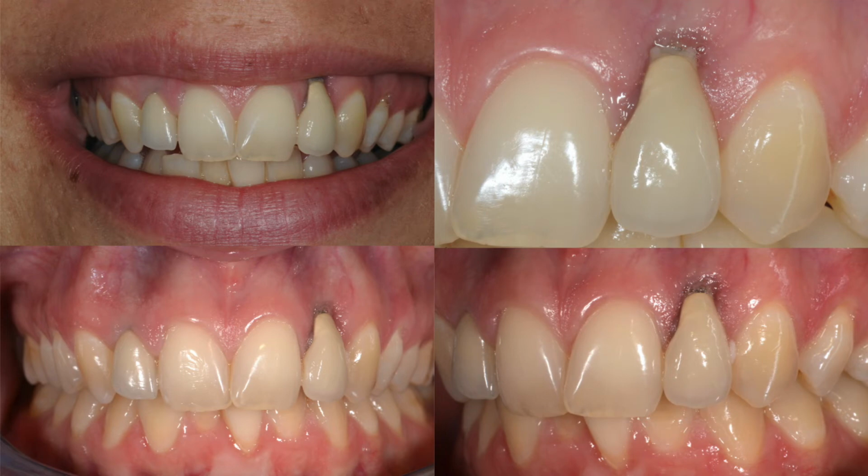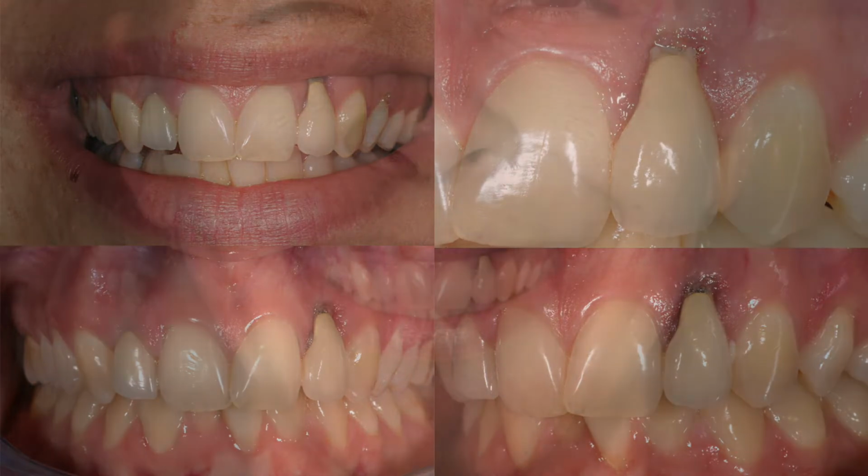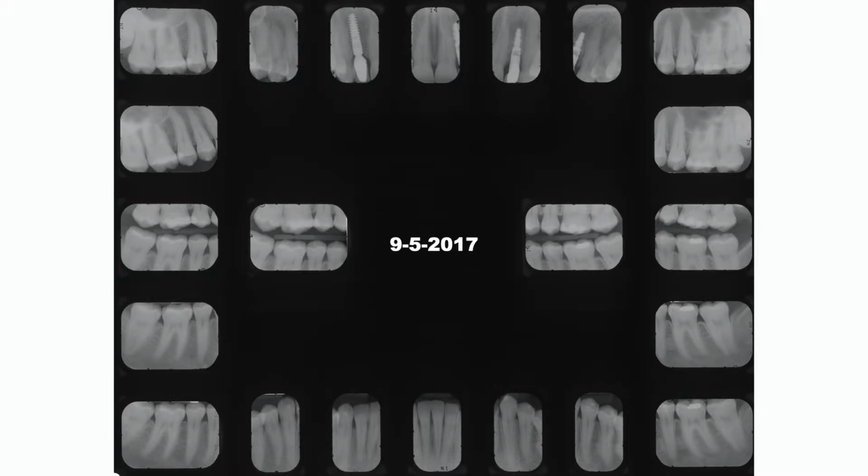That's not a high smile, that's not exaggerated. It's a very natural smile, and obviously the restoration is in her aesthetic zone. So, the full mouth series: nothing remarkable. Pretty uneventful, a healthy person with good periodontium.